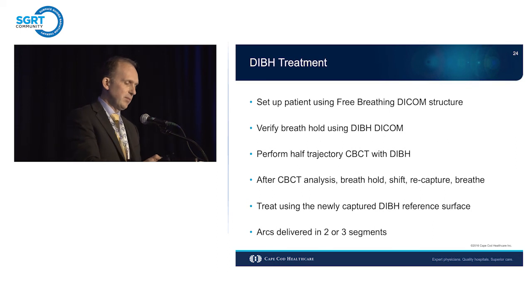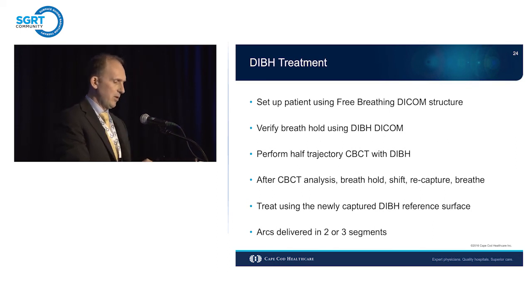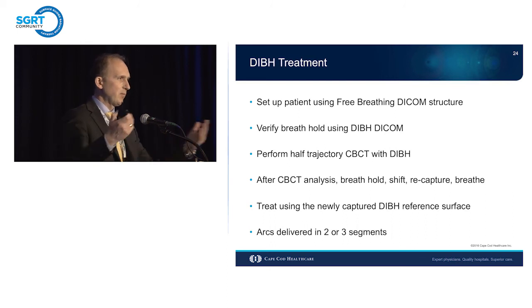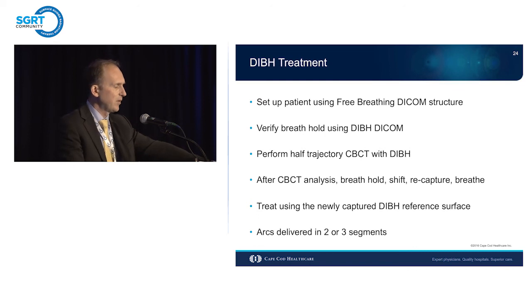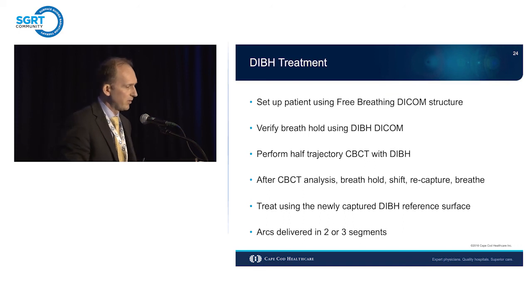The resolutions seem not to be aligning with each other, the DICOM and the camera, and there's a lot of jumping deltas when you have both arms out with the KV source, the cassette, the gantry. So potentially you can block 2 cameras at the same time, and if you have a DICOM surface that you're trying to use to monitor your patient, that can be tricky sometimes, and not making you very comfortable. So a recapture always helps. As soon as you determine that you're doing the right breath hold, might as well do a recapture and use that resolution for monitoring.